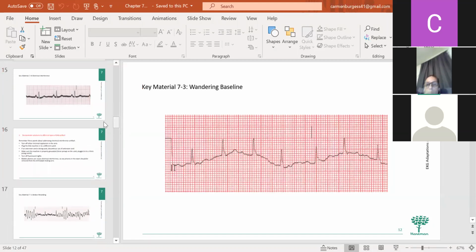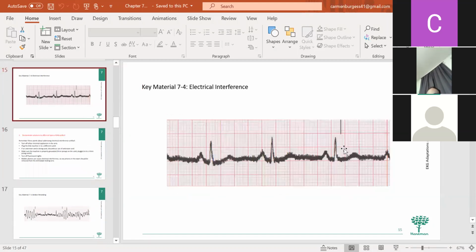So when you see that and you want to know what kind it is, how about this one? Is this giving you electrical? Right. So yes, it's dark, it's thick. It's like so many electrical things going through at once. It's just ridiculously jammed up. But you can see the heartbeat, right? You can see that contraction is taking place, right? How do we know this? Here, here, here. That's what we're fixing to learn in the next chapter.